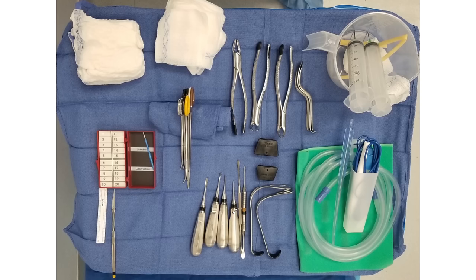These are used to basically pry out a tooth. I mean, they're like little pry bars that you might see in a mechanic shop. Here's our ringed instruments. So you're seeing two smaller hemostats here. This is a tonsil hemostat that's longer. That's my preferred instrument. And then this is a needle holder here for holding a suture needle.